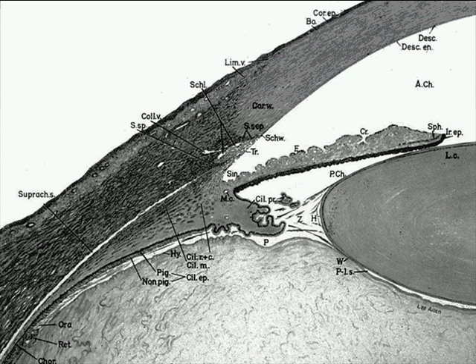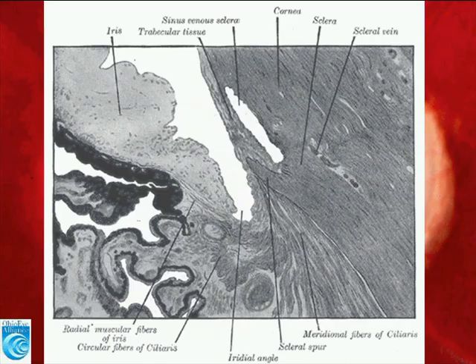It's also important to remember what is peripheral to these structures and deep to these structures as we go through the anatomy of the eye. So really, it's important to think very anatomically as we go through this talk. Looking at another view, we see a very similar thing, this time facing the other way. We can see the anterior chamber angle centrally, slightly to the left.